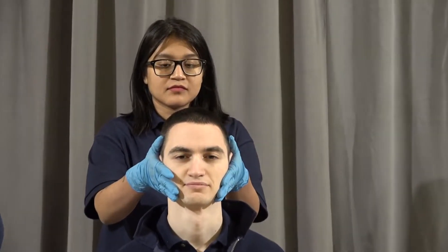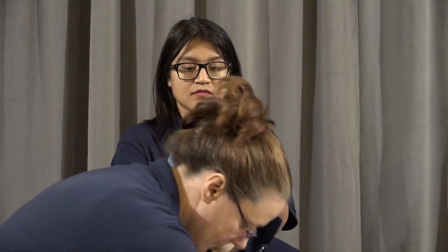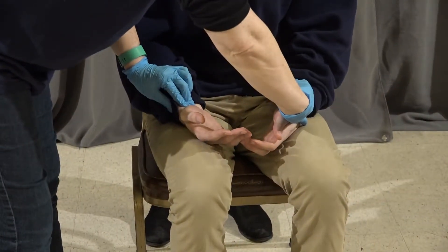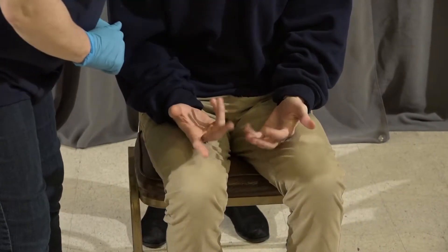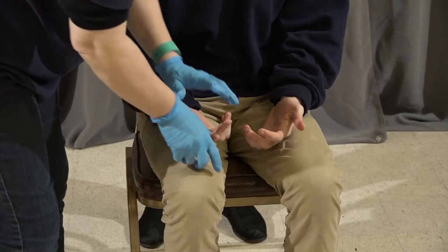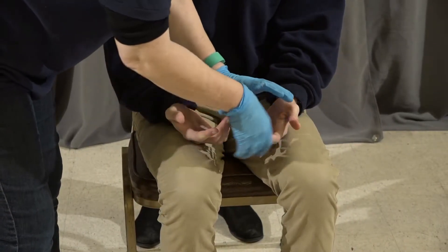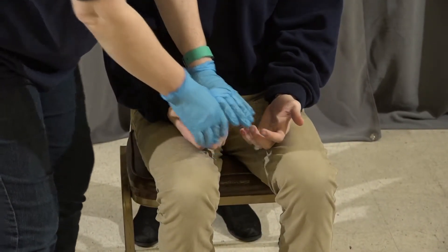I'm going to assess pulse, motor, and sensory starting with the hands. I'm feeling for radial pulses. Wiggle your fingers for me please. Which finger am I touching? Which finger am I touching?